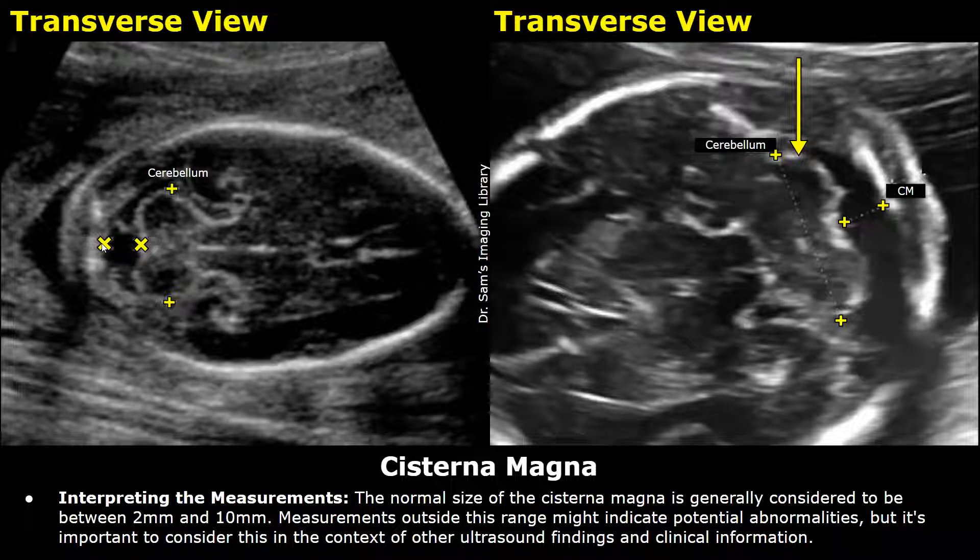The normal size of the cisterna magna is considered to be between 2 to 10 millimeters. Measurements outside this range might indicate potential abnormalities, but it's important to consider this in the context of other ultrasound findings and clinical information.